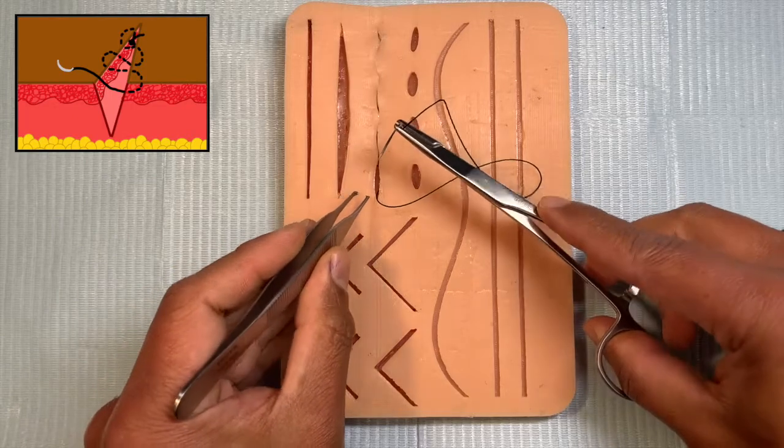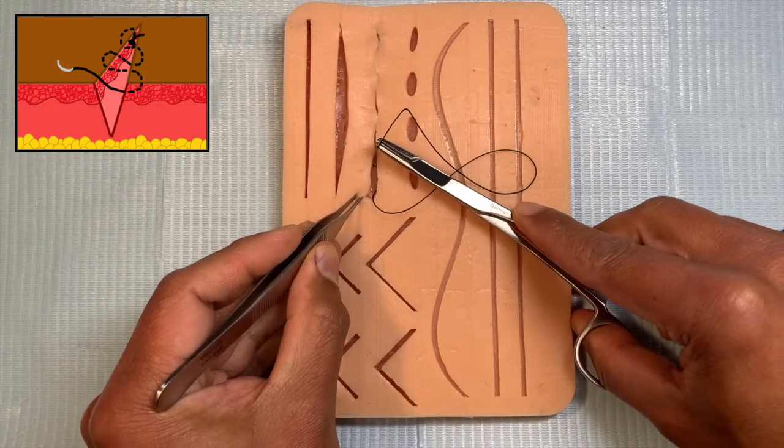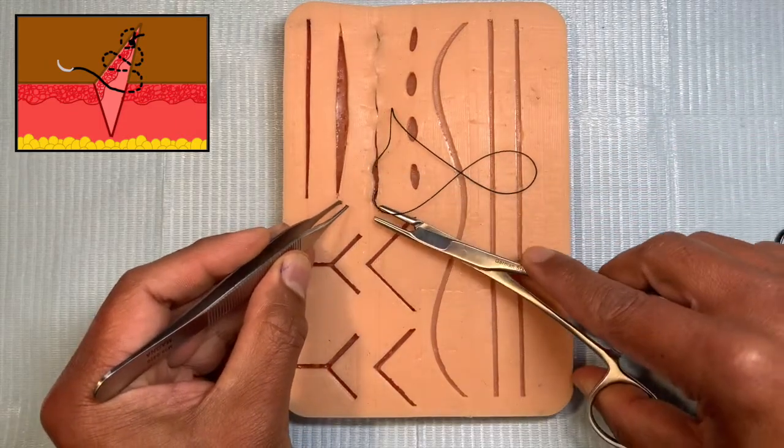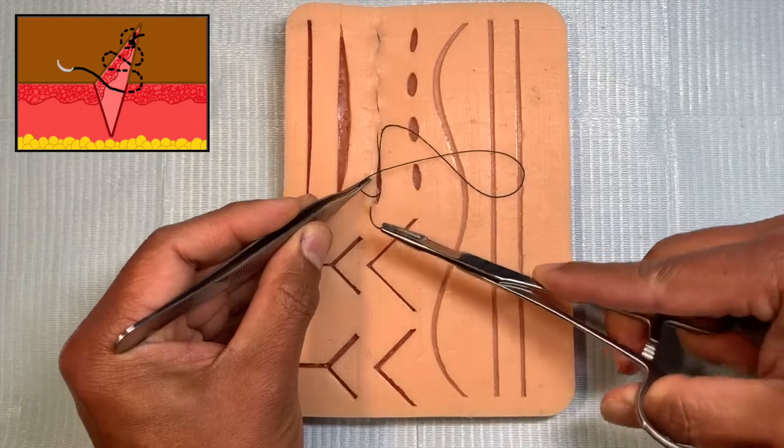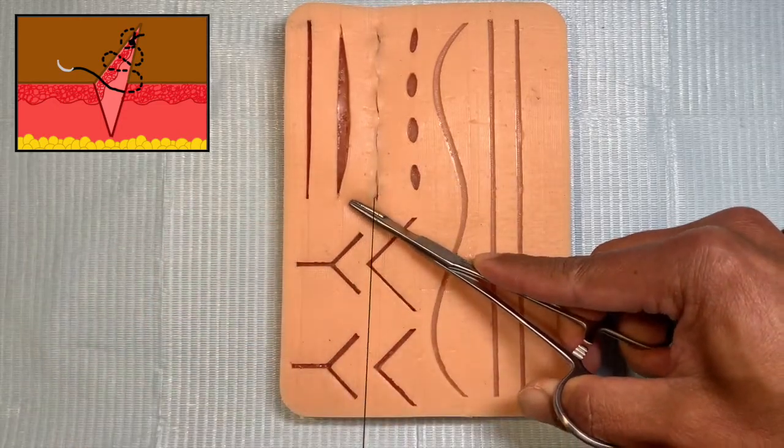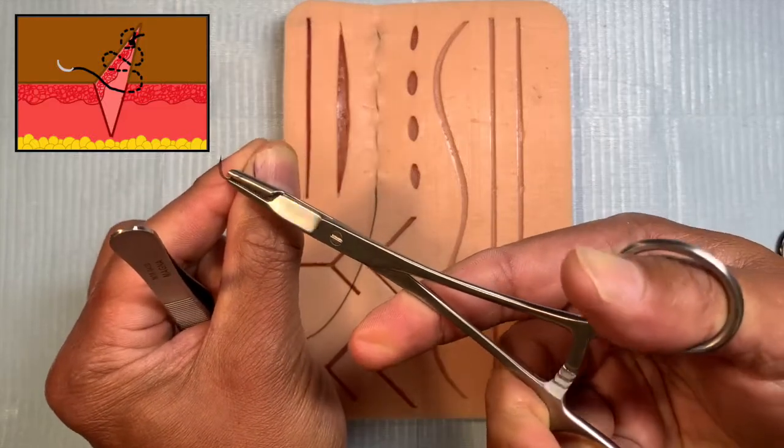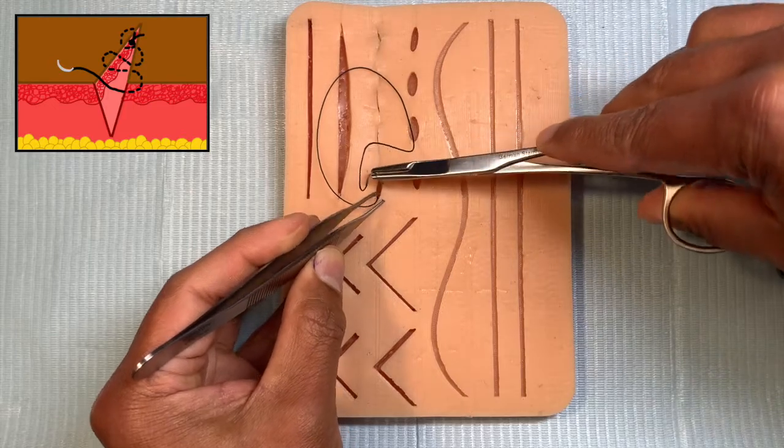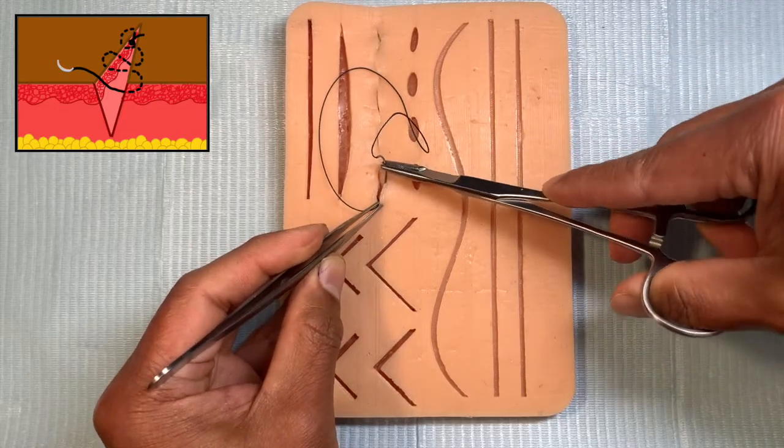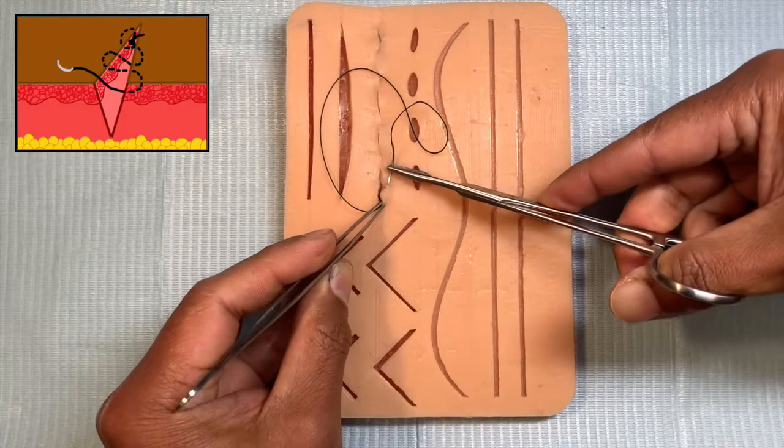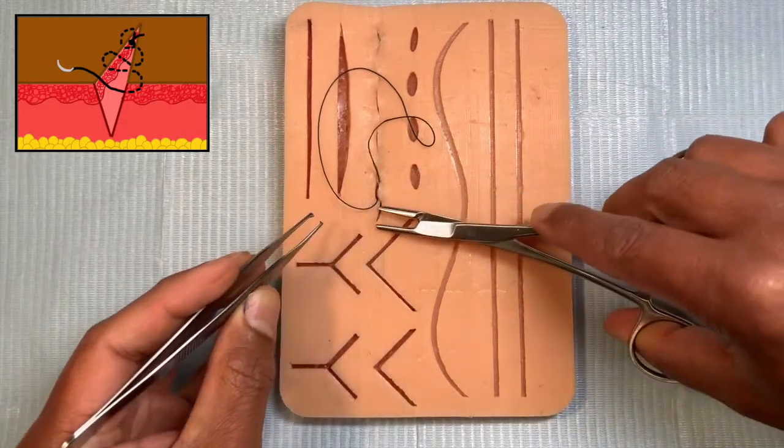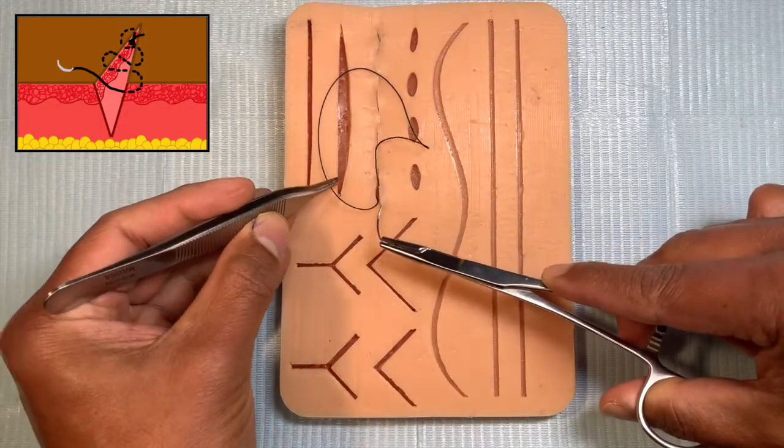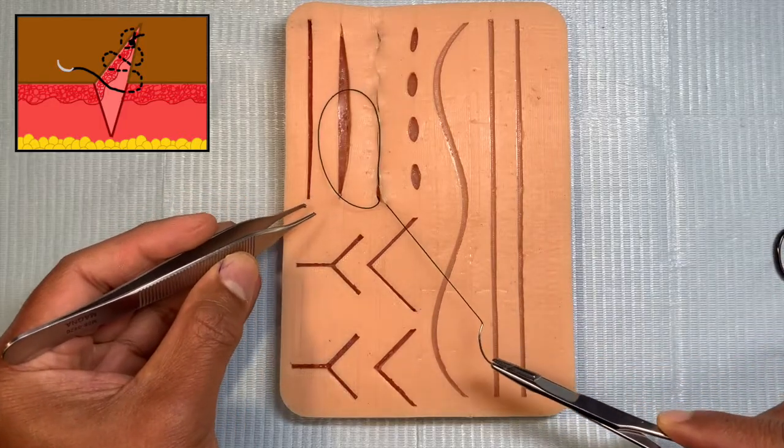We're coming to the completion of the intracuticular suture, so now we have to finish off. The technique I'm going to demonstrate is called the Aberdeen knot technique. Come up pretty close to the very end of the wound because you want to make sure everything is closed. I've taken a bite and left one end long, so now I'm wrapping the suture up.